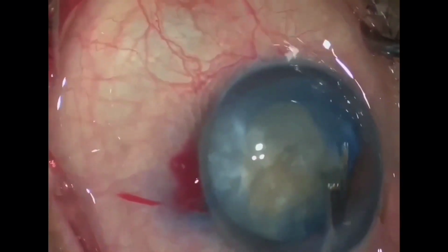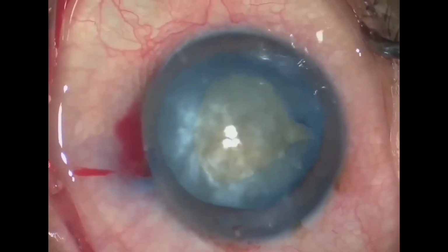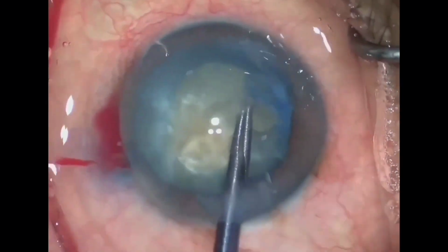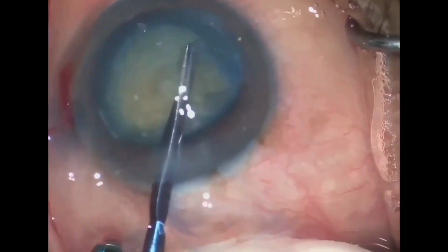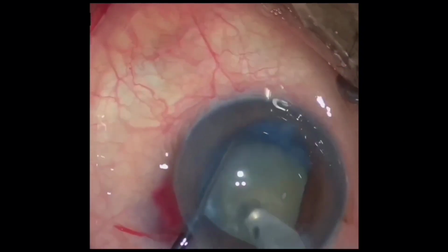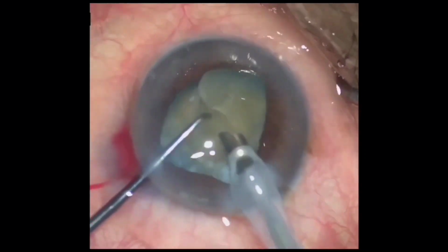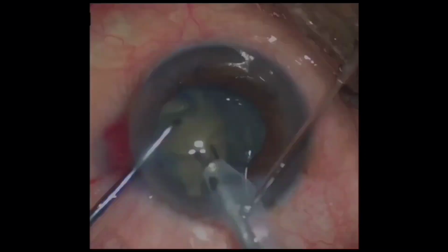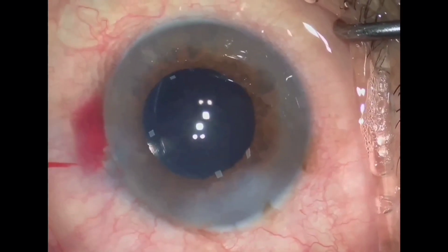To regularize the capsular rhexis, the capsule was again cut at the point of extension and rhexis was enlarged with the rhexis forceps. After completion of the rhexis, the nucleus was emulsified by the direct chop technique. At the end of the surgery, we observed that the reflex was blue instead of the normal red reflex.